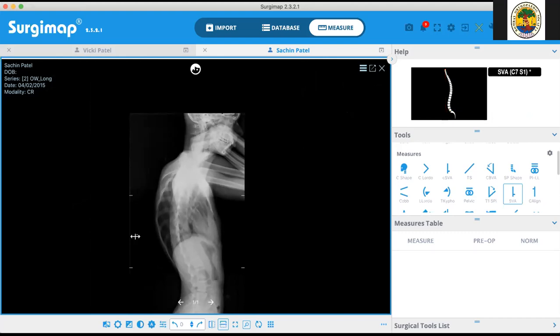I think it's very hard. You need a really good X-ray for that. Okay. So the same issues. Because most of the time, you can see this patient's hand is not positioned properly. The patient's hand should be in front of the shoulder, not on top of the shoulder. Should be holding the clavicle. So it should be on the clavicle and it should be in the front.